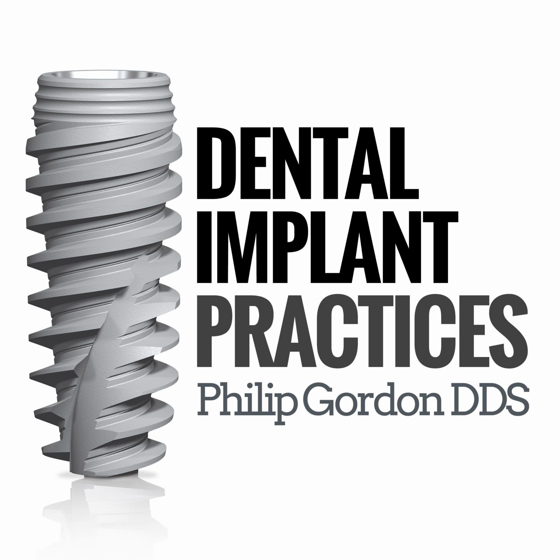So the next thing to do after your final osteotomy is shaped is to pick up the implant. Now, I like to pick up the implant with the handpiece. I like to turn that down to 25 revolutions per minute or 50 revolutions per minute with 35 Newton torque. And I will pick up the implant with the implant motor and start placing it in the bone and rotating it. So initially, I am rotating and maxing out the torque at 35 Newton centimeters. Now, typically, if things go as planned, the implant will stop a fourth of the way short.